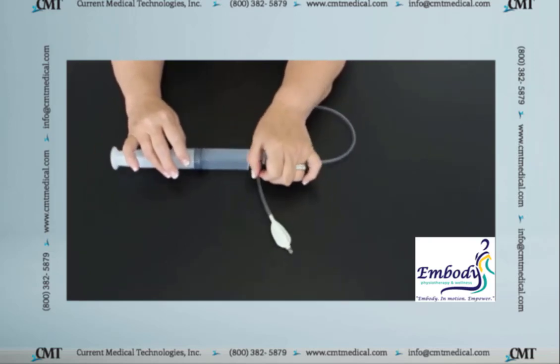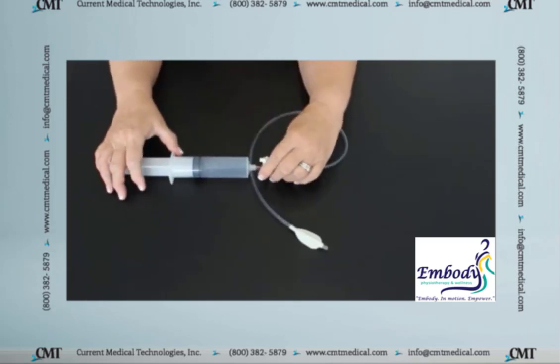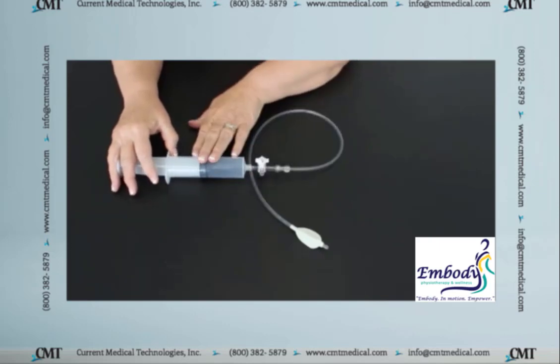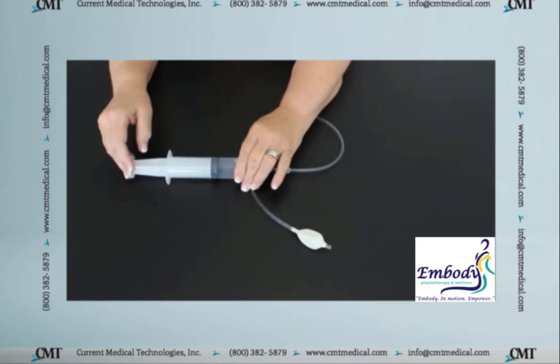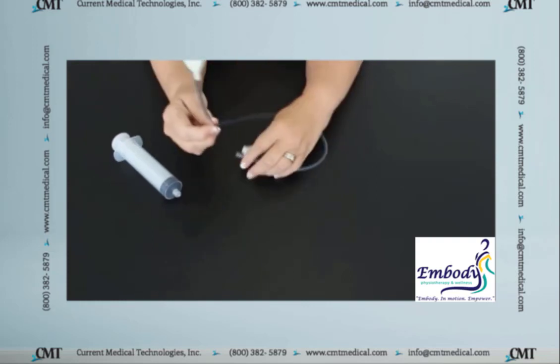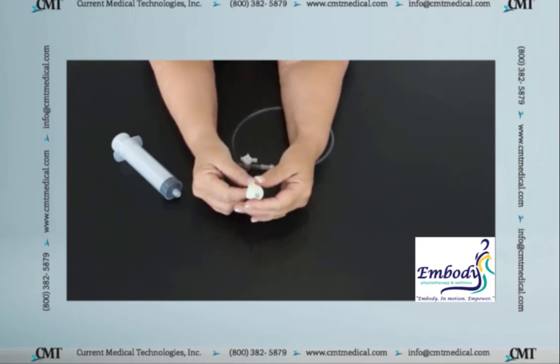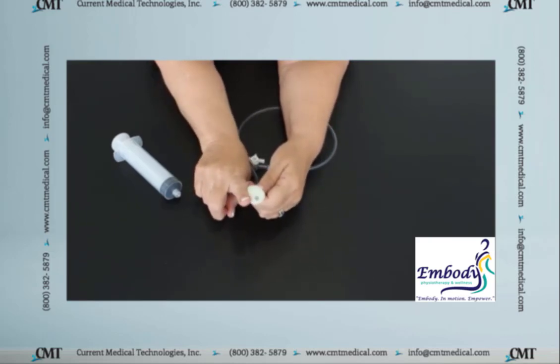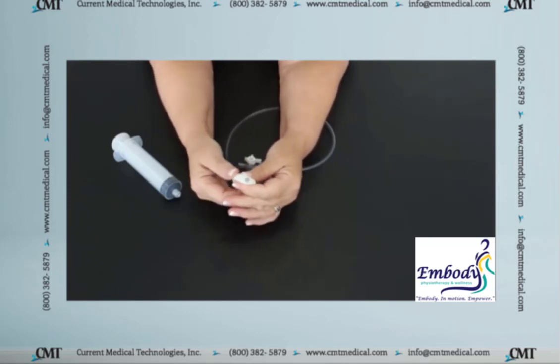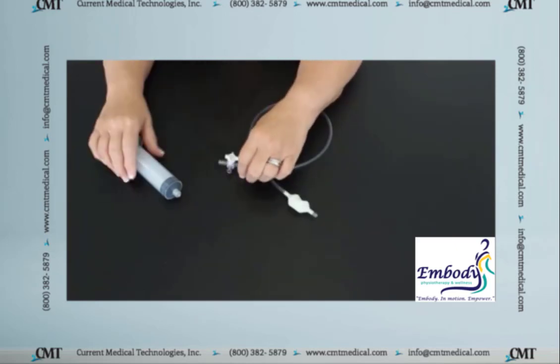Now, when you get these balloons out of the package the very first time, they're not going to be as deflated as this balloon is. One of the things you're going to want to do — I'm going to show you what the balloon looks like when it comes in the package. It's going to have a little bit of air in it, and the syringe will be closed, so this is how the balloon will come out of the package. You want to be sure before you insert the balloon in anybody that you deflate it all the way. Because the tube of the balloon is much smaller than my finger, but if we have air in this balloon, it's going to be very difficult to push it through because air is not compressible. So it's going to be hard to push this through the anal canal. You want to deflate that balloon right away.